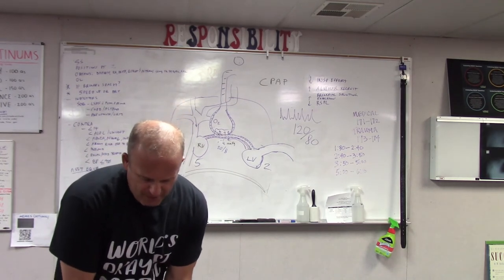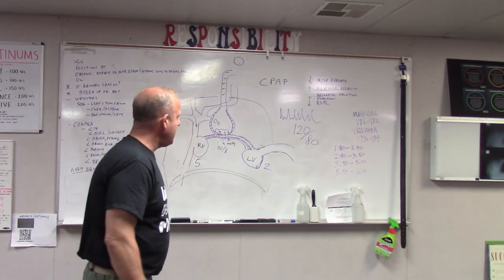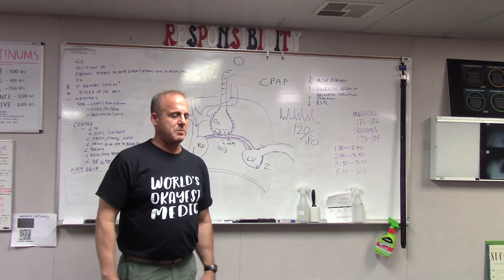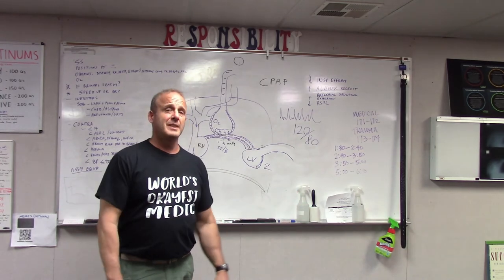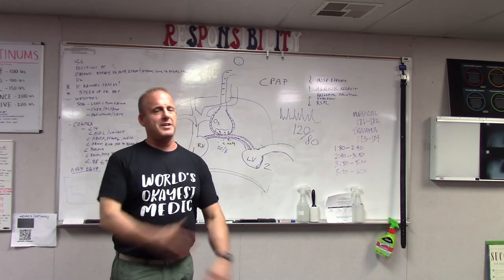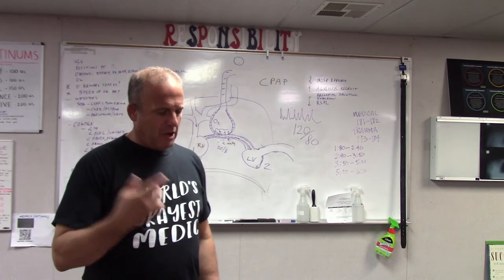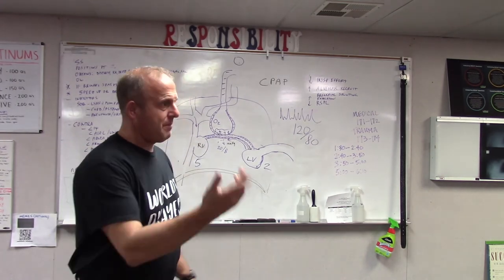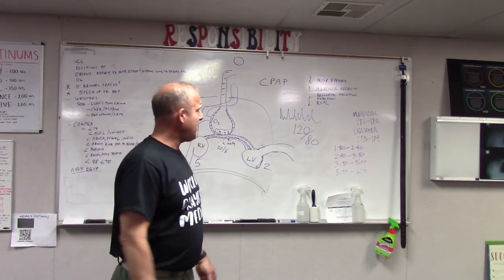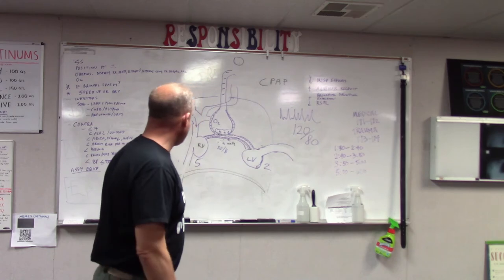The truthful part of it is back when we didn't have CPAP and back when we didn't have capnography, one of a medic's worst fears was a patient with difficulty breathing, because so many things can cause it. You get someone who's shut down, they have COPD, pneumonia, pulmonary edema, everything at once, you don't know what the hell's going on. So you wind up doing all we could do back in the day, which was give them albuterol. Who's thinking left-sided heart failure and pulmonary edema? We didn't really know what the heck it was half the time.